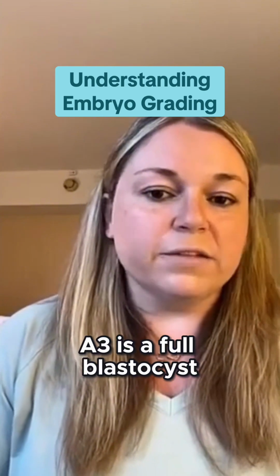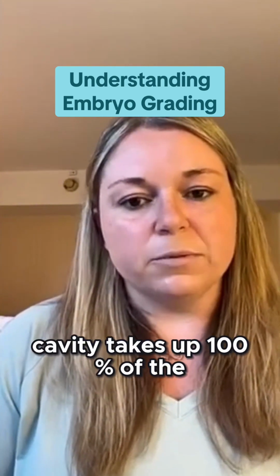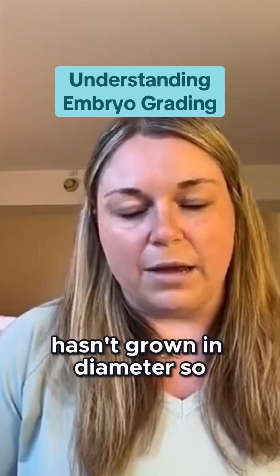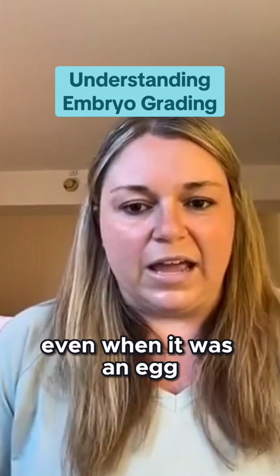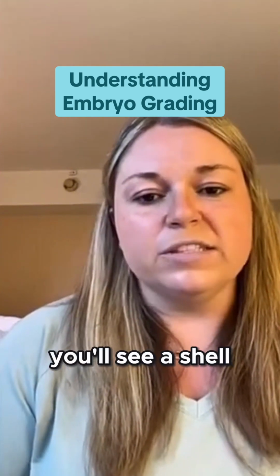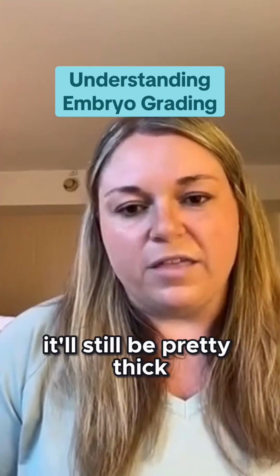A 3 is a full blastocyst. That means that the cavity takes up 100% of the embryo's space, but the embryo still really hasn't grown in diameter. So it's still roughly the same size it was even when it was an egg, maybe a little bit bigger, but not much. And at this point, you'll see a shell around the embryo. It's called the zona, and it'll still be pretty thick at this point.